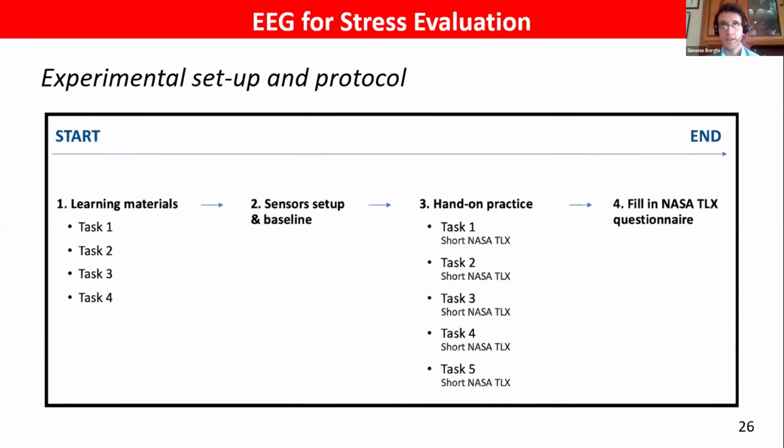Participants watched a series of emotionally evocative videos. Subsequently, participants, now equipped with sensors, proceeded to complete the tasks introduced during the initial learning phase. Additionally, they performed an additional concluding task, task 5. During this phase, real-time recording captures signals, errors, and reactions, providing valuable data for stress analysis. Concurrently with task execution, participants complete a brief subjective evaluation using the NASA TLX subjective questionnaire.